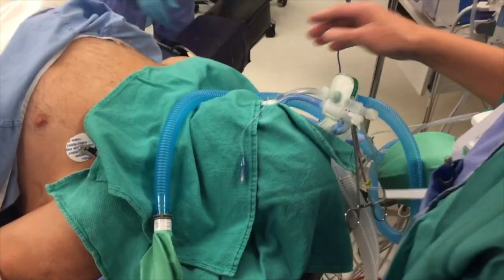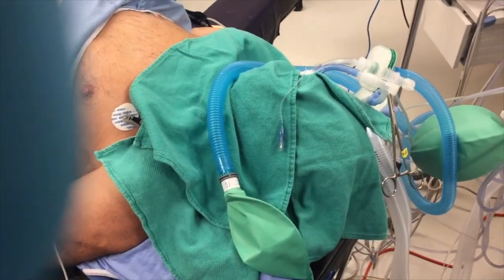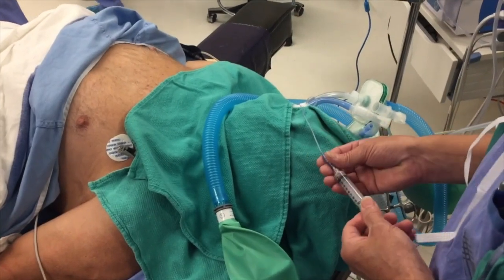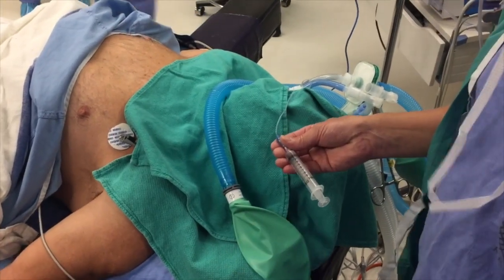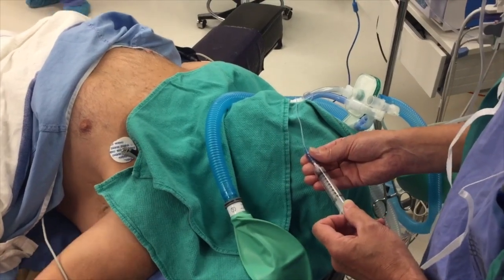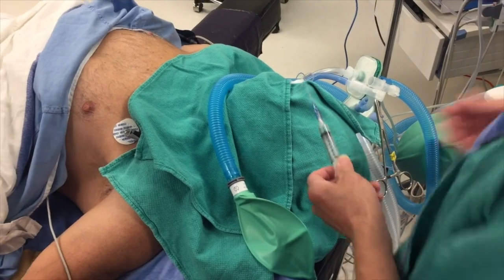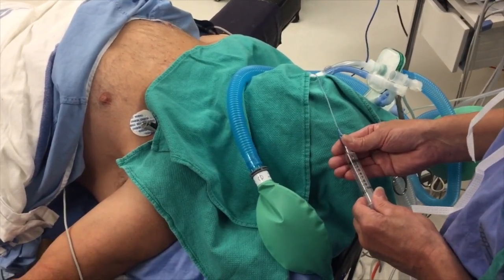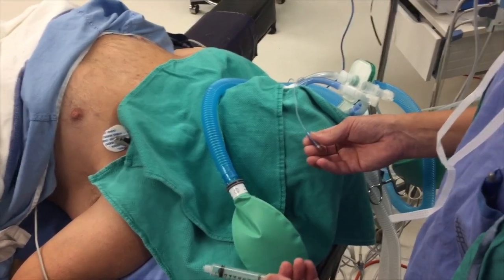I attach my bag, there's no leak, the cuff is in the correct place. Now I'm going to show myself creating a leak, and this is how we determine how much air to put into the distal cuff. I'm going to withdraw air slowly. Make sure I'm ventilating here. I'm going to withdraw air, and there you see the bag begins to inflate, there it stops inflating. So it's a minimum amount of air in that distal cuff we need.